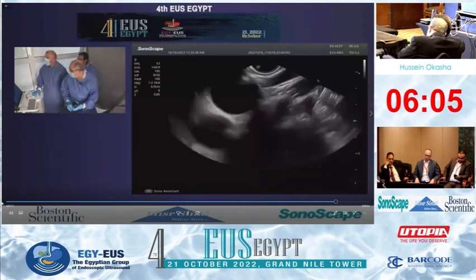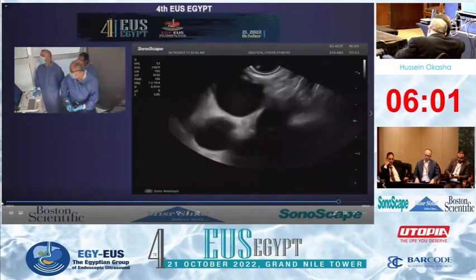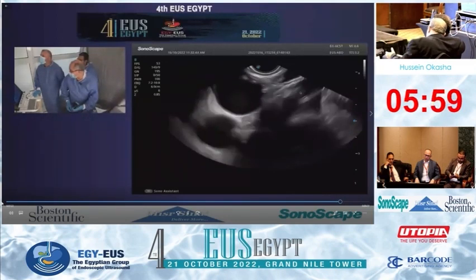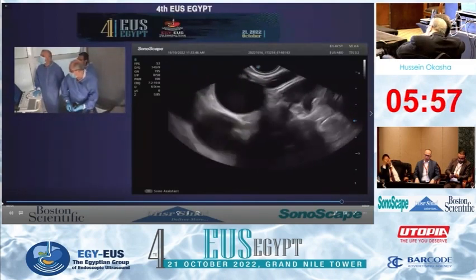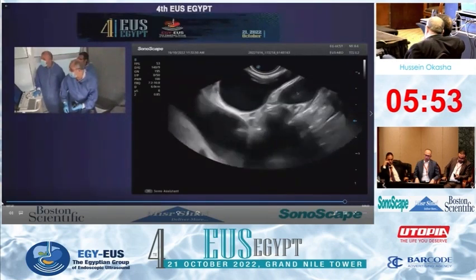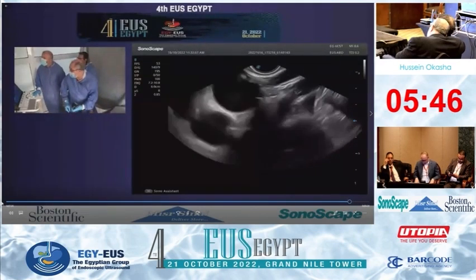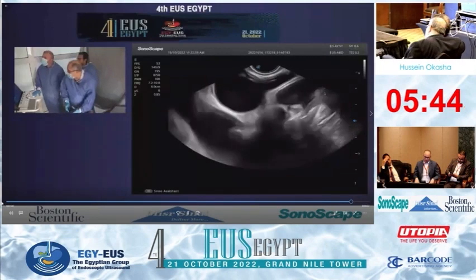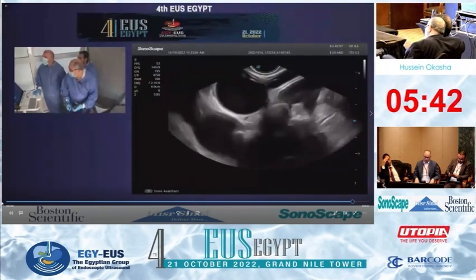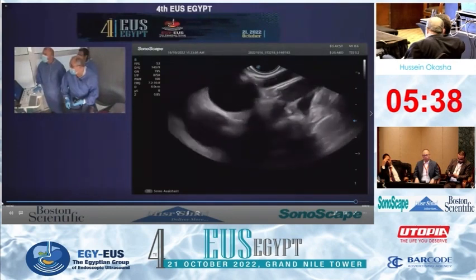No, above. This is the left internal jugular, uniting with the left subclavian coming from below to form the left innominate or left brachiocephalic. Here at the venous confluence, I can see station 3A, 3 anterior. Yes, here this is 3 anterior. Very nice. And here this is the common carotid above.